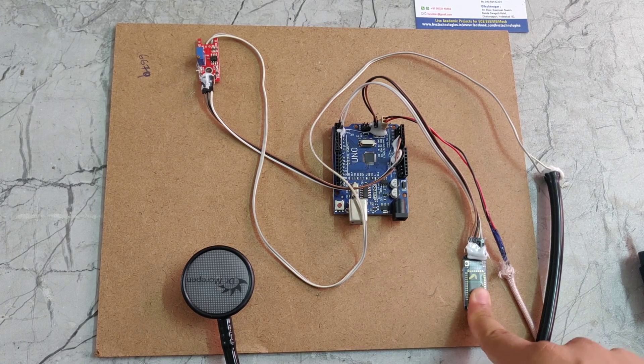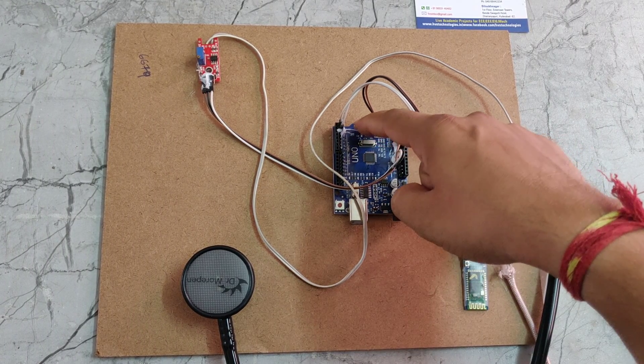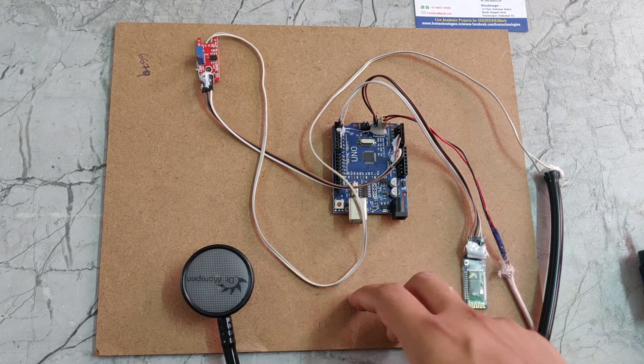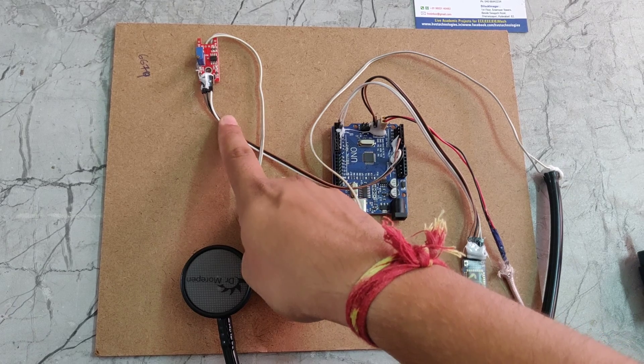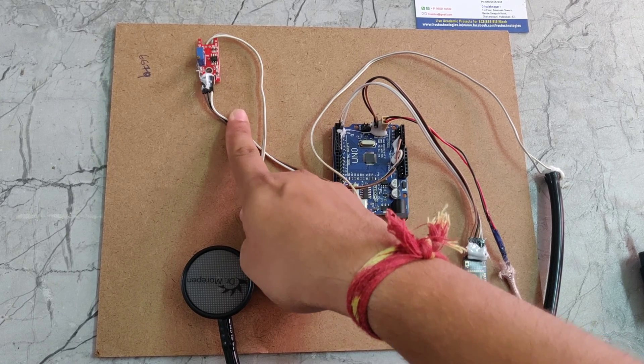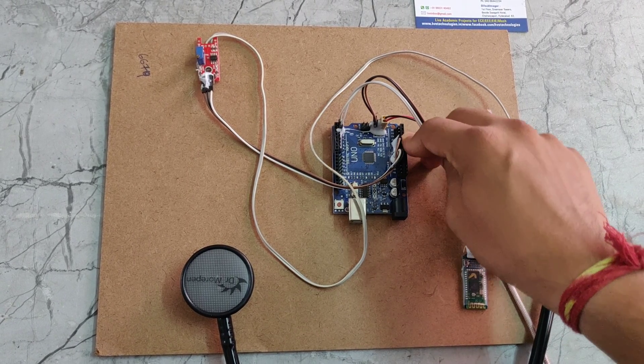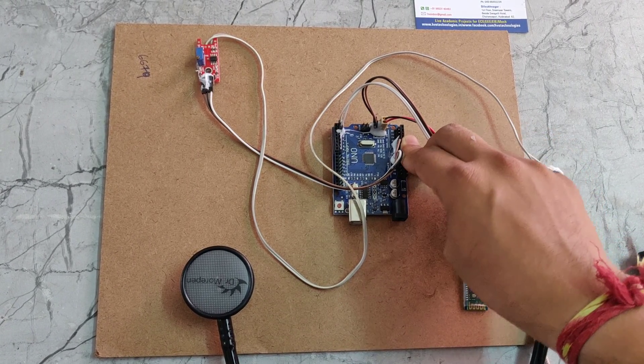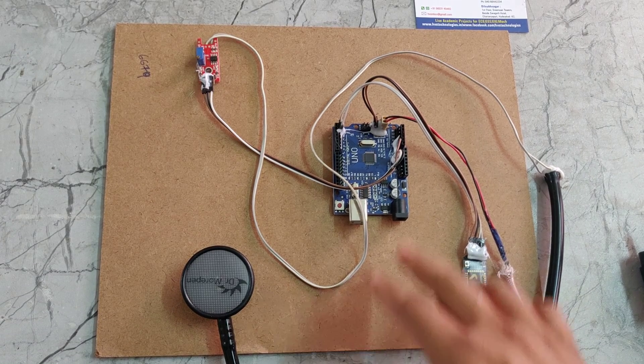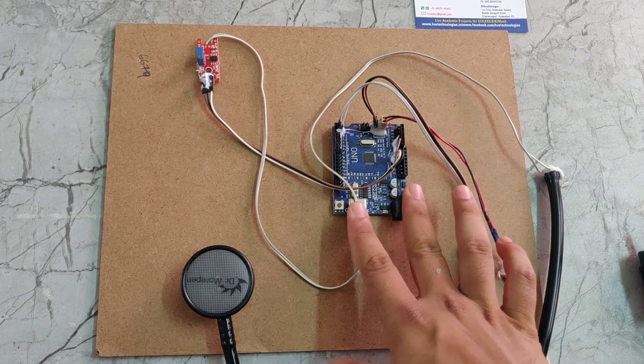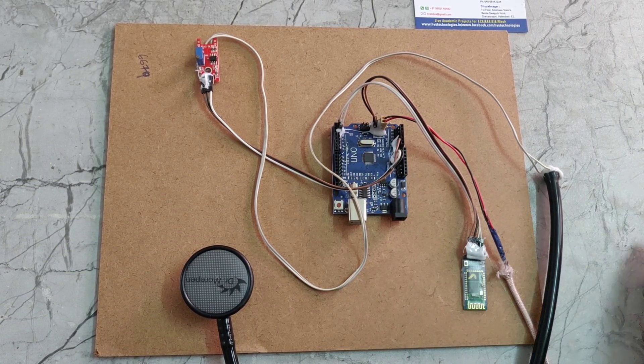The Bluetooth module is interfaced with pin number 0 and 1. The sound sensor is interfaced with pin number A1, connected to the analog pin. We can see that the power supply is also connected to this Arduino board.